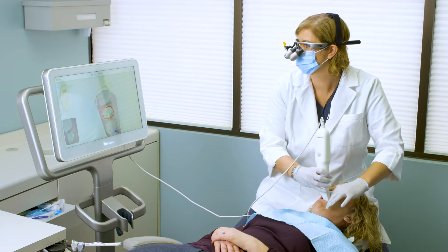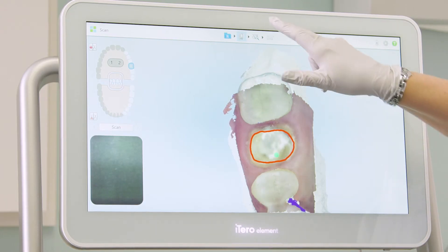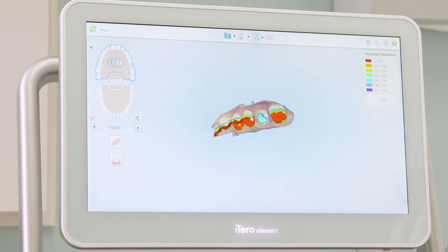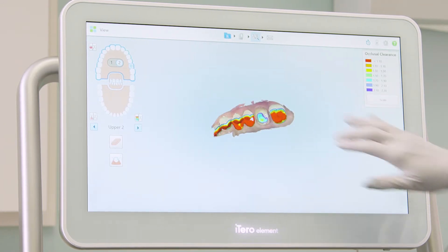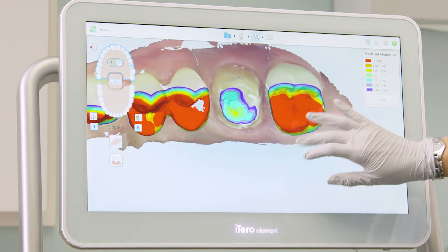And tap on the view icon to see the adjusted model in high resolution. I can also use the eraser tool to remove any artifacts that are on the margin.